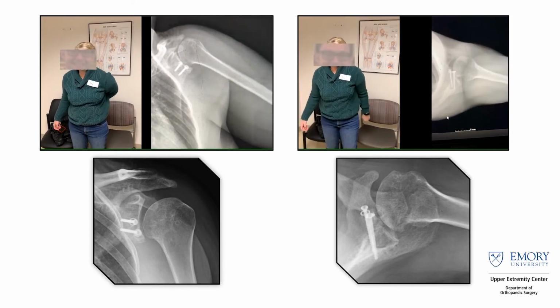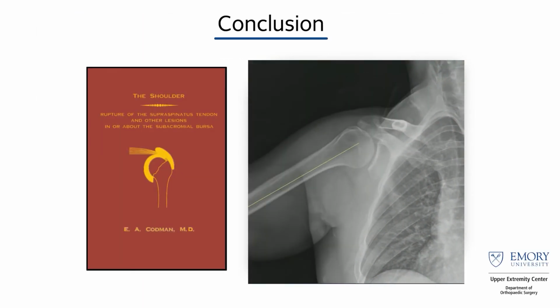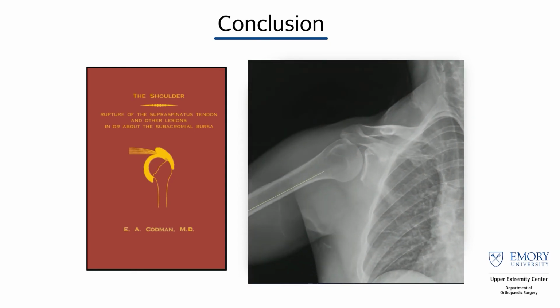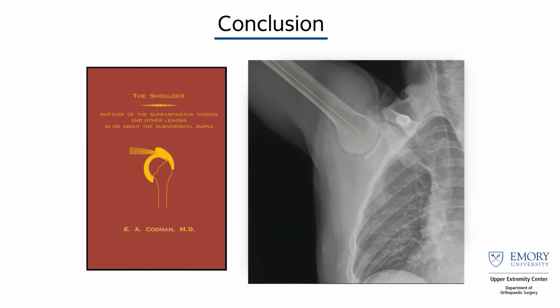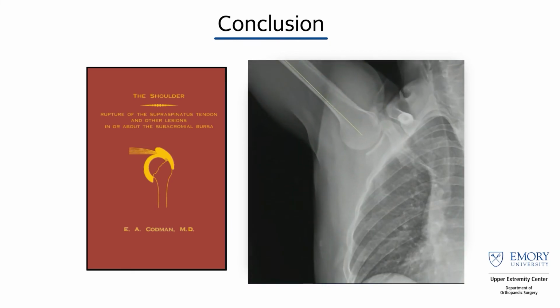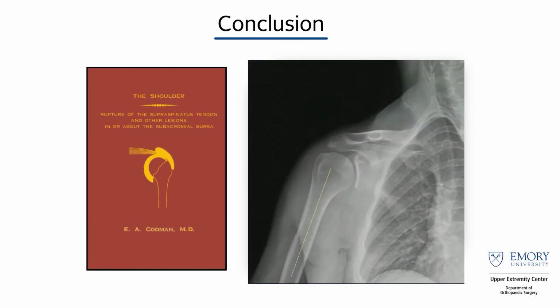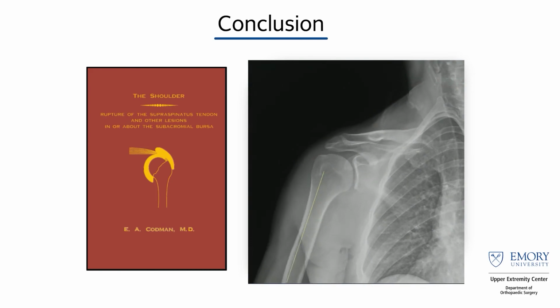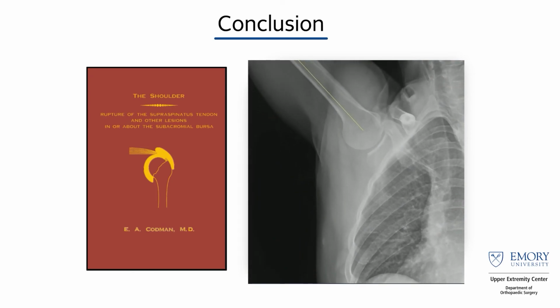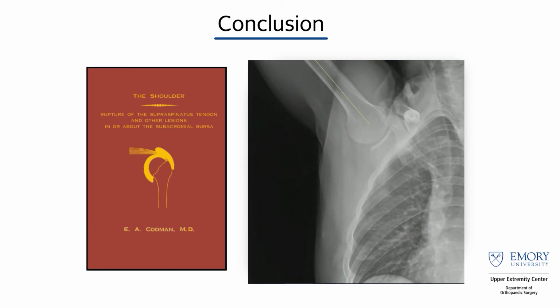a bigger platform. So in conclusion, the reason why I like this technology and the reason why I get quite excited when thinking about its future is it really gives you some cool insight into what's going on besides what you try to interpret based off some static views. It's like looking at a picture versus looking at a video. You get so much more information from a video. They say a picture's worth 1,000 words, but a video is worth 1,000 pictures. I mean, you get so much more off these videos.